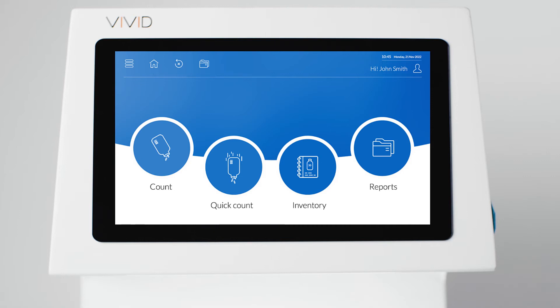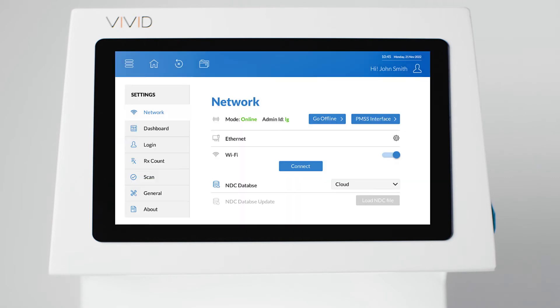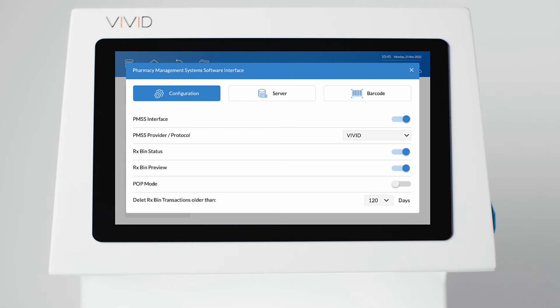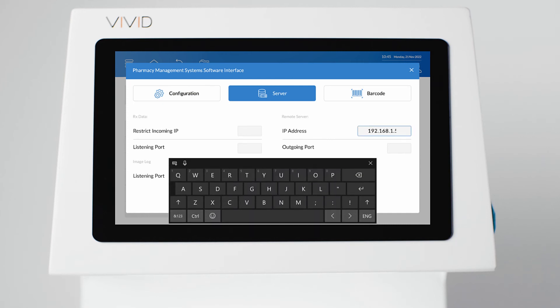Before continuing, make sure that you know the remote server IP address and outgoing port of the computer or server that runs your software. You can now enable and configure the interface. Press Menu and select Settings. Select the Network tab and press the Interface button. Enable the interface and select your provider. Press the Server tab.